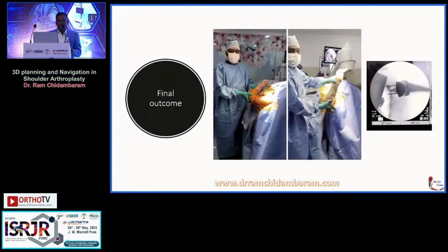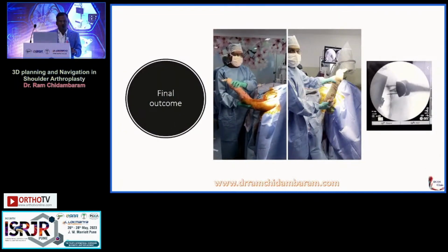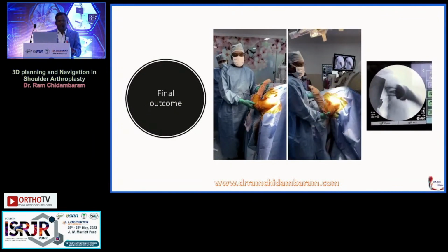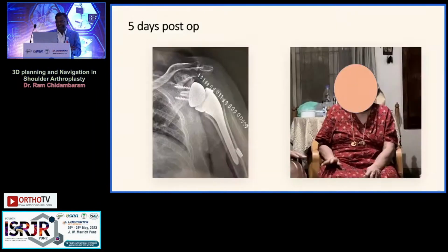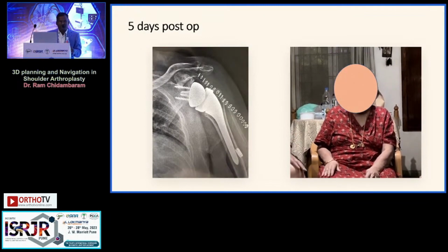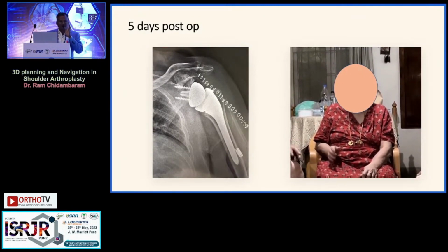Immediate post-operative, as I said, I always do this for each and every patient to check the stability after my reverse shoulder, as well as the full abduction and rotation, and X-ray screening to make sure it is stable. So that is the patient. She's a singer and she's happy, comfortable sitting, fifth day post-operative, singing her classical songs.